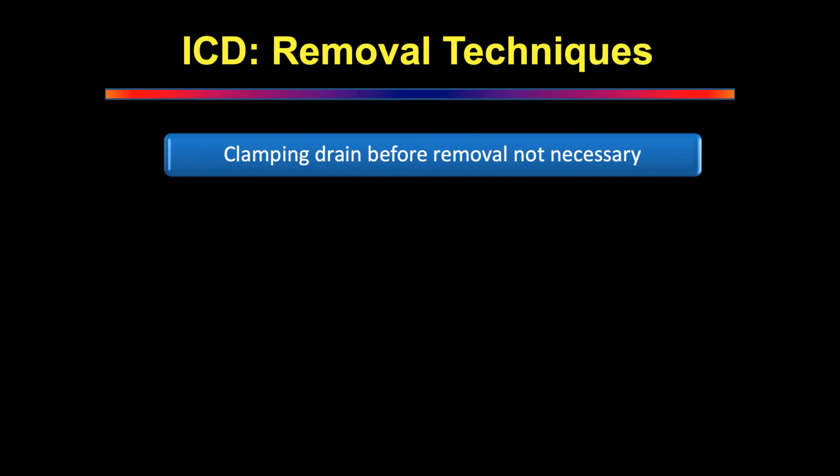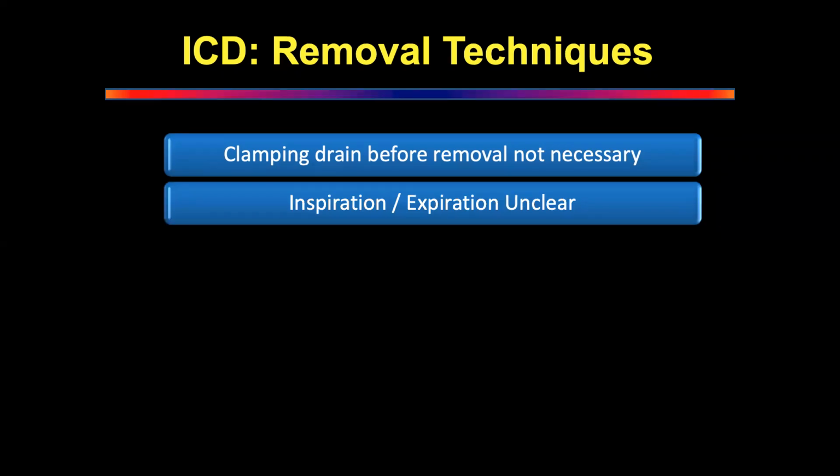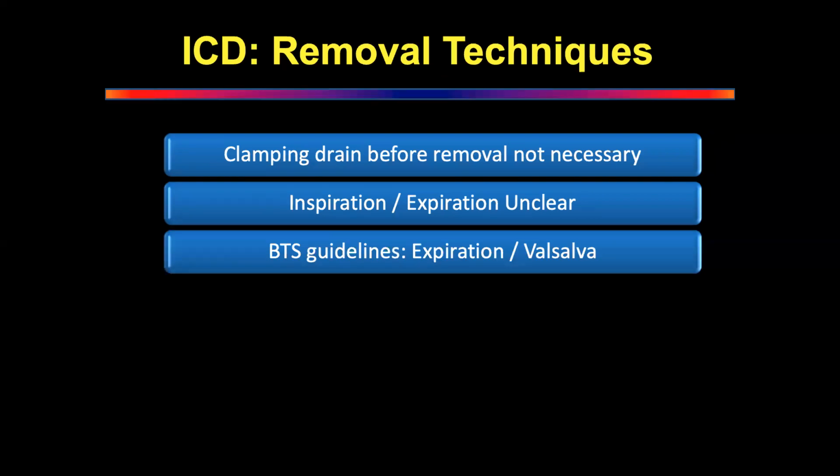Somebody else wants anything different? Expiration, sir. Excellent. See, that's the problem. It's actually not clear whether it's inspiration or expiration. If you look at the literature, it's not clear. But the BTS guidelines say that it should come out at the end of expiration and Valsalva maneuver. This is the guidelines.